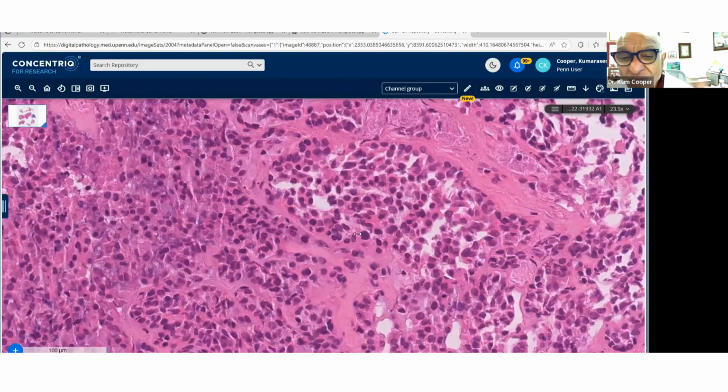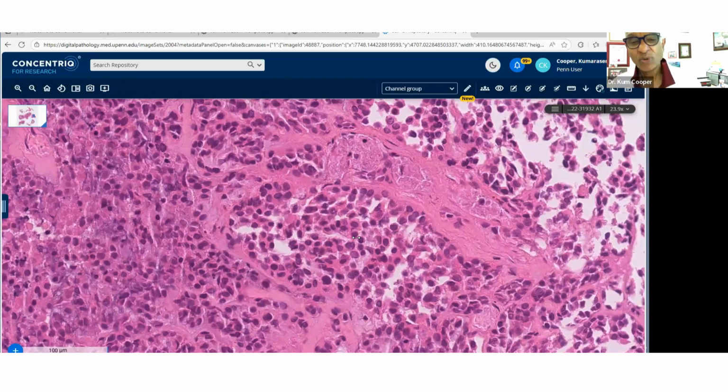So glomus is a good thought, but glomus has a very well-defined cytoplasmic border as well, and is really cohesive, just to go back to the suggestion earlier on. So PEComa is also very good, lacks the vascularity, but you may argue, oh, this could be a sclerosing PEComa. Fair enough, fair enough. But Ewing sarcoma, just morphologically, I would do a CD99 just to rule that out.